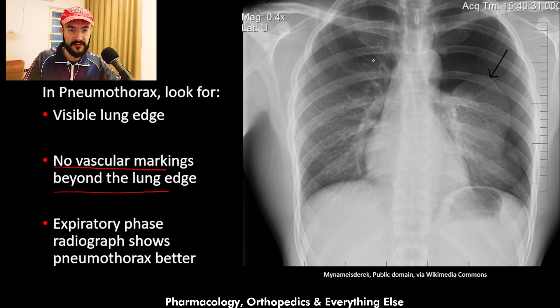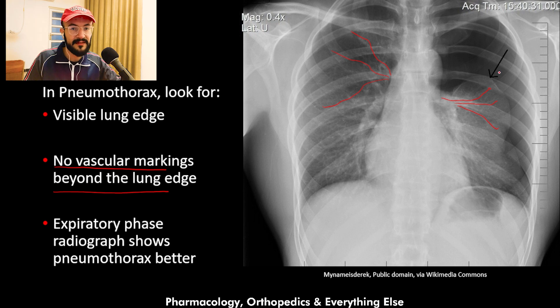In a normal lung, vessels spread from the hilum towards the lung lobes. In the pneumothorax lung, the vascular markings reach near the edge but do not extend beyond it. The area beyond the lung edge is very black — more radiolucent — because there is no lung tissue and no vascular markings there.